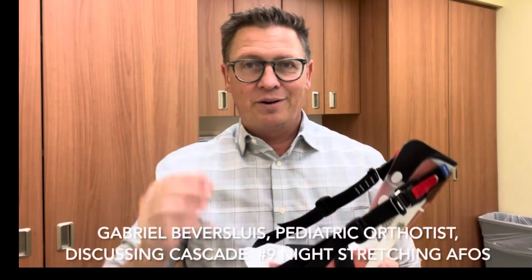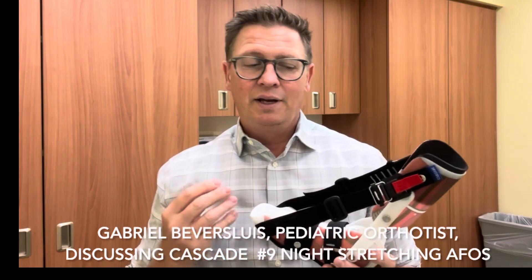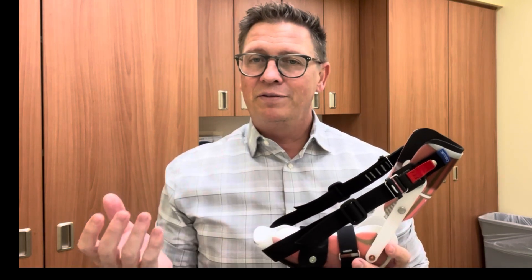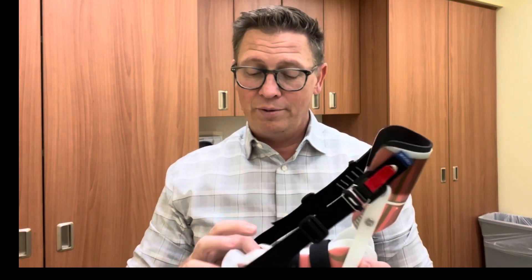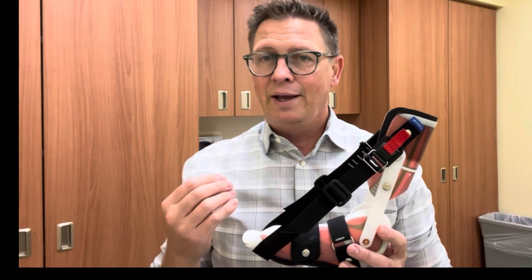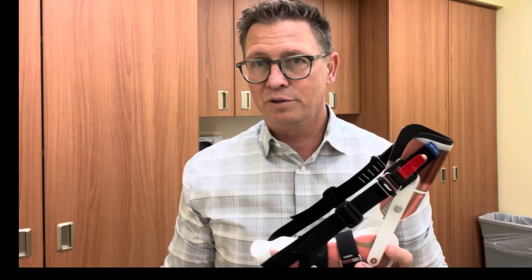All right, today I want to talk to you about Cascade number nine nighttime stretching AFOs. There are a few different types of night stretching AFOs available. This is one that's ordered quite frequently, so I just want to go through instructions on this one and show you how we set them up and how I believe they should be used.